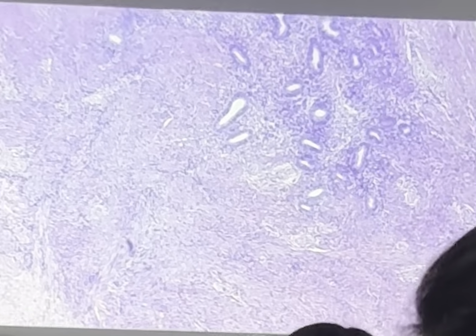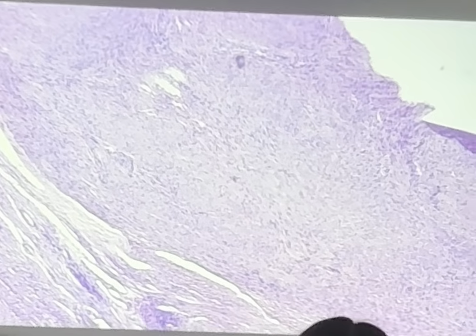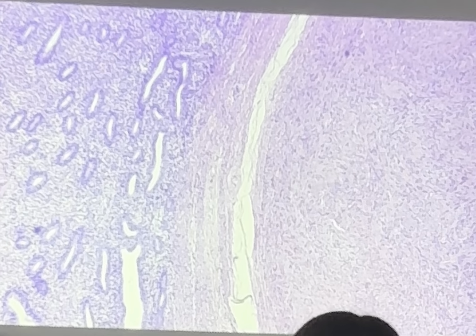But if we go to the side, there's something a little bit distorting the myometrium. You have this nodule. See this nodule on the right? In the myometrium, we see this round ovoid tumor, and it's somewhat distorting the endometrium because it's pushing up against it. What do you think this tumor is?